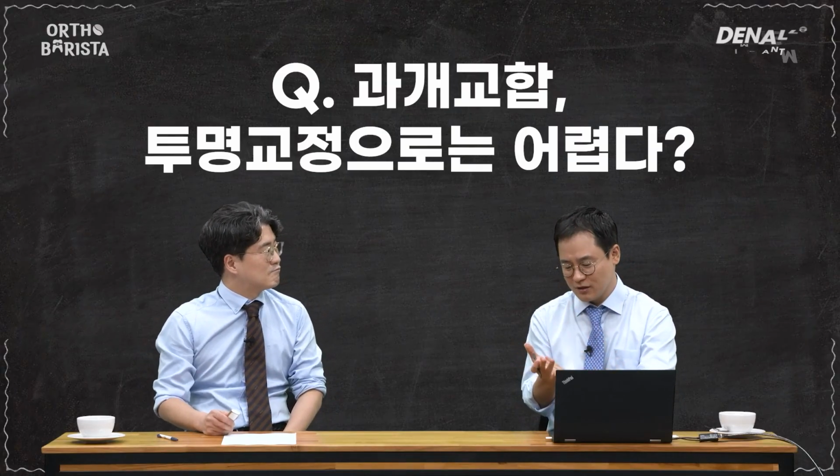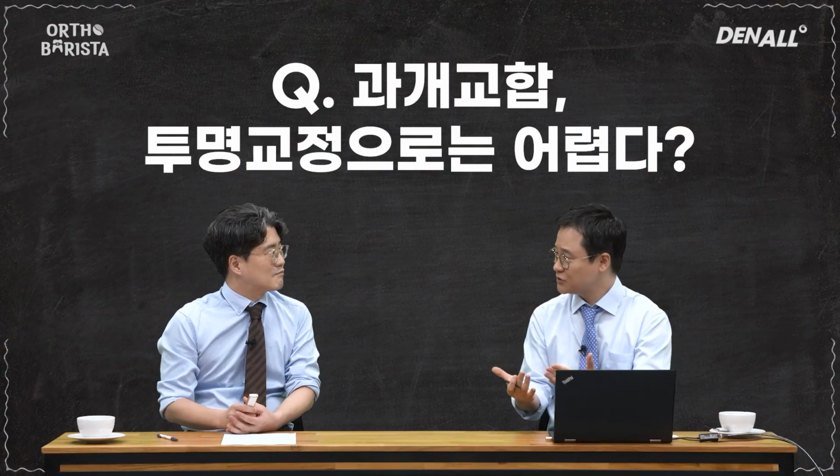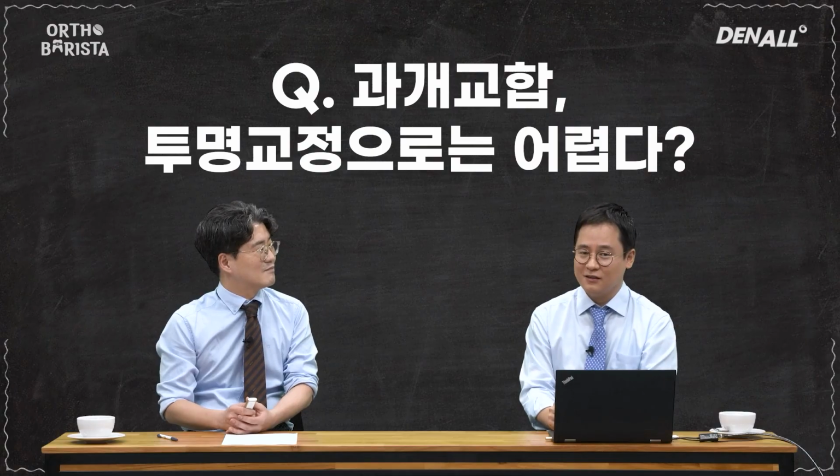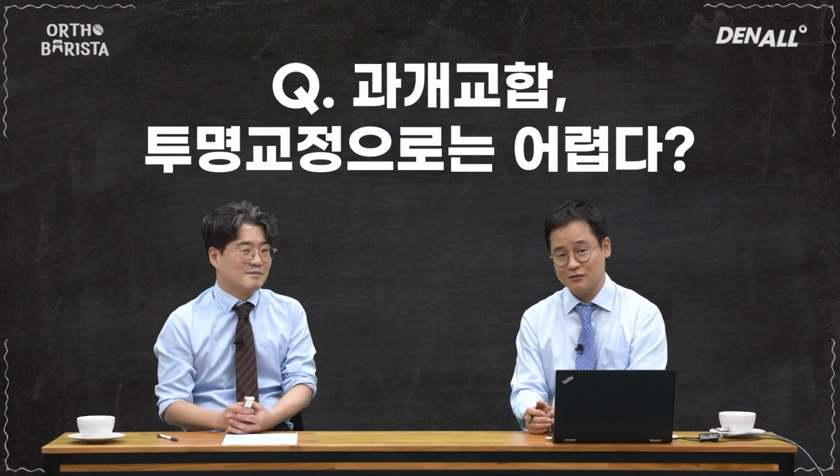First, you cannot place brackets on the mandibular anterior teeth. Yes, that's right. So, to deal with that issue, you need to do a lot of work. So in that sense, this can be quite a good solution.